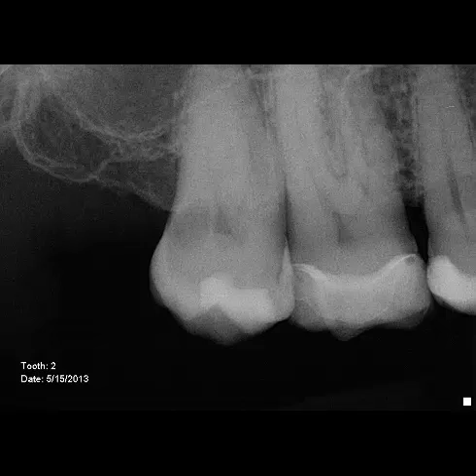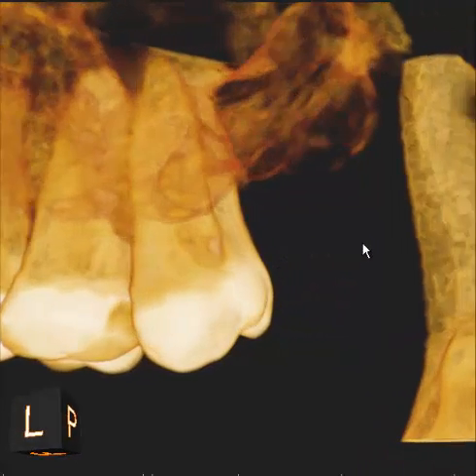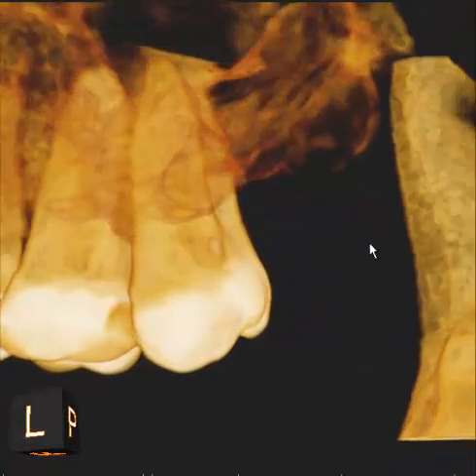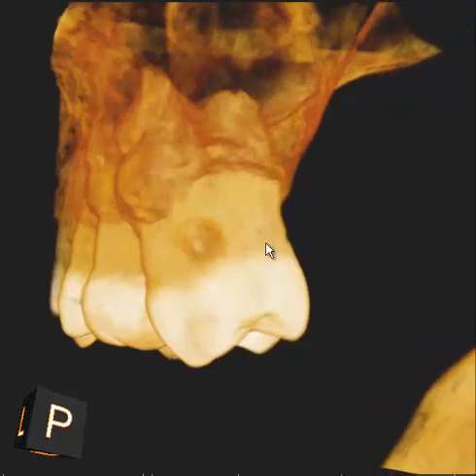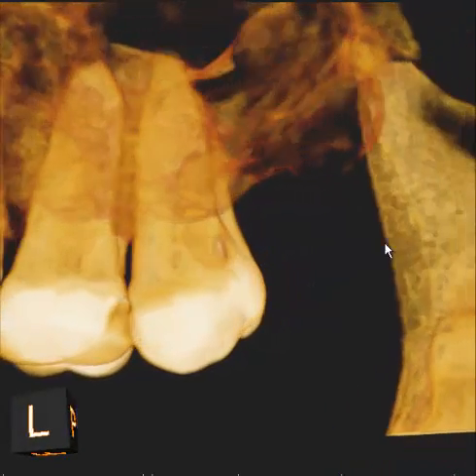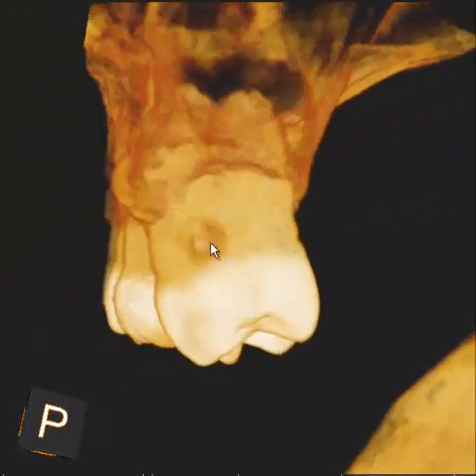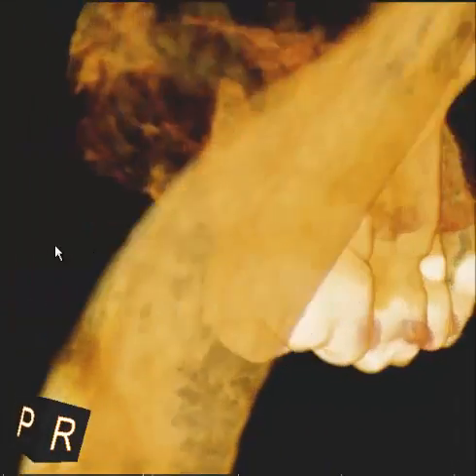Let's take a look at the power of this 3D cone beam CT imaging. As you look at this 3D image, you can rotate the tooth around and see very clearly that this is a limited crater at the distal palatal aspect of this root.